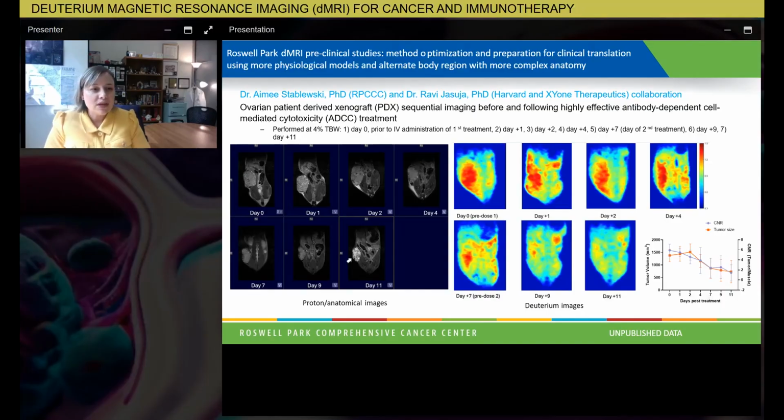Well, you might say 2 days, does that really matter? Because, in 2 weeks' time, you'll actually see the tumor regress. But it matters because in patients, the pseudoprogression can last for weeks and months. So the time frame here is compressed, thankfully, because it's really expensive to image both mice and humans by MRI. But it gives us this idea that potentially we have a way of seeing pseudoprogression. And I'll remind you again, this is a very safe imaging technique. So MRI does not involve using ionizing radiation or X-rays like CAT scans or X-rays.